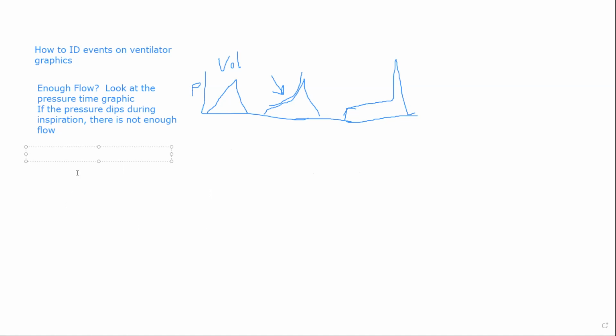Do you have adequate sensitivity? So again, you would look at your pressure time graphic.